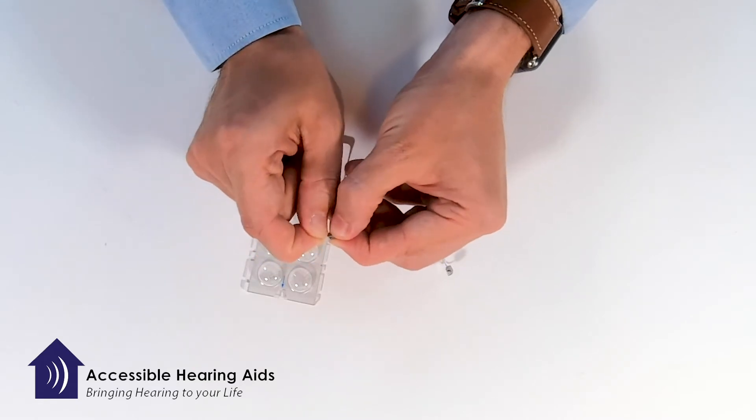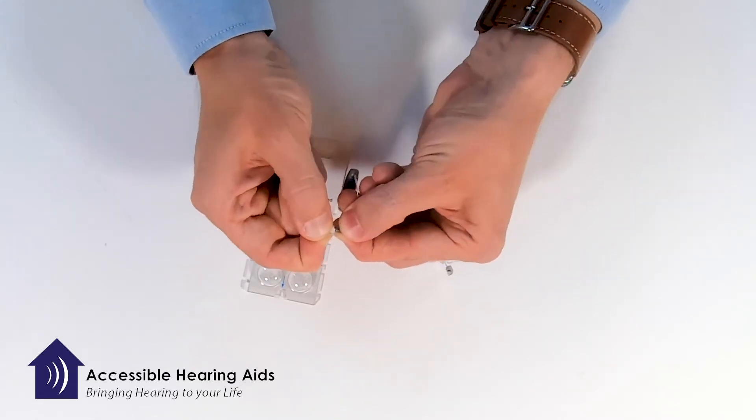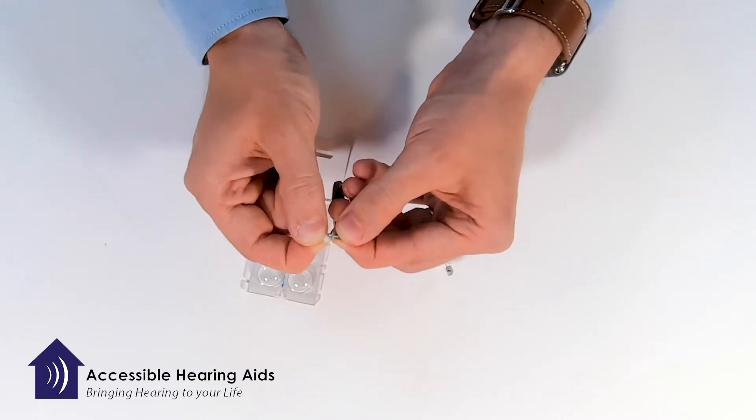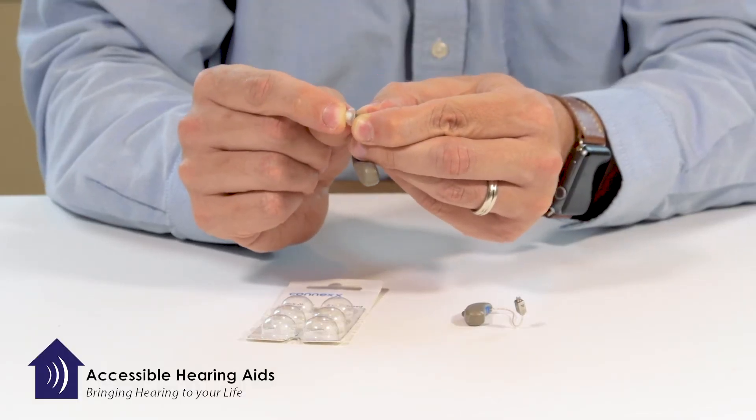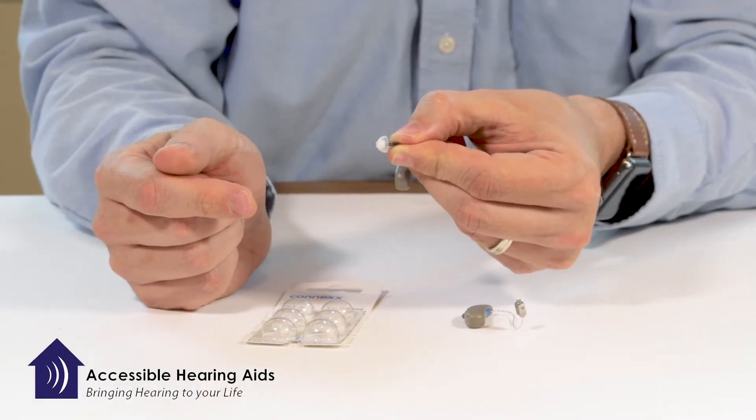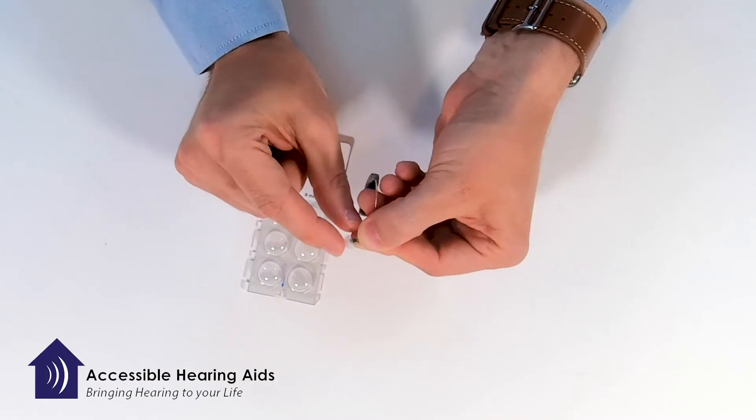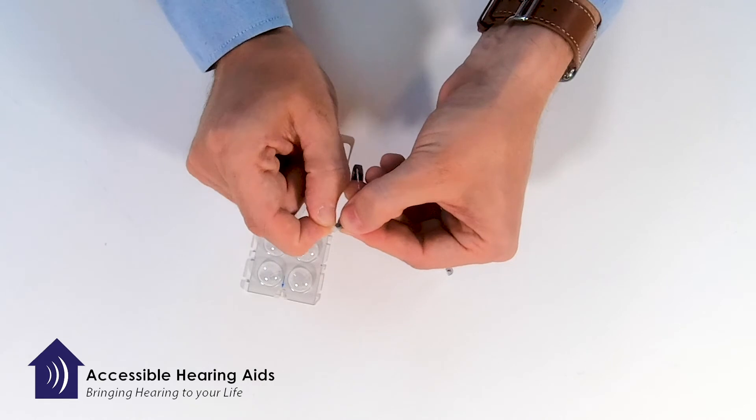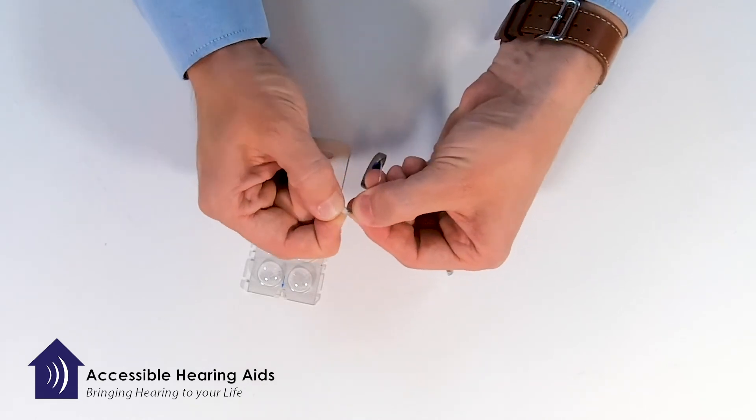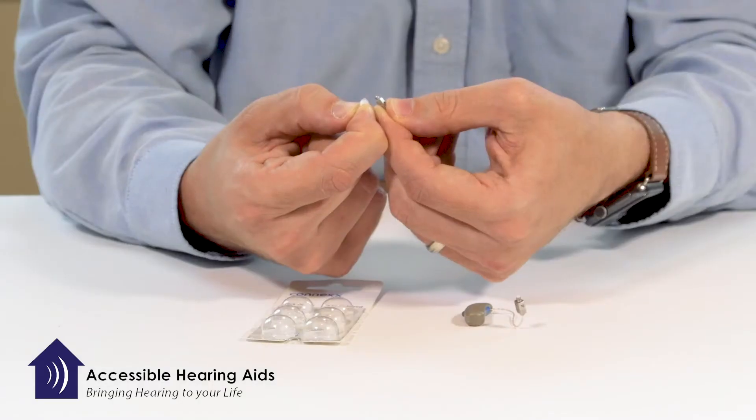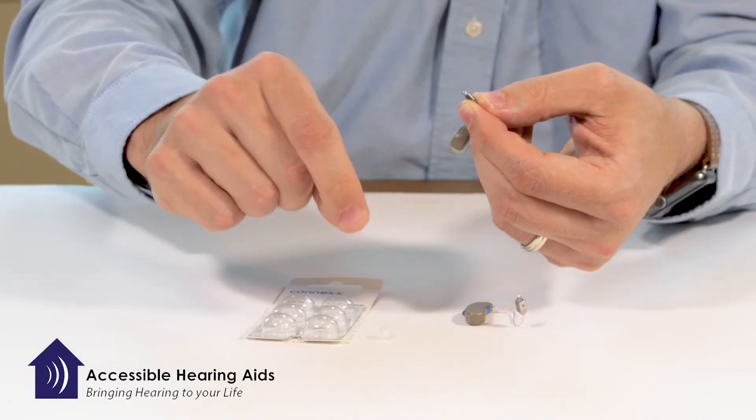You kind of pull apart and then split down. I like to think of - I grew up around a farm with my grandfather and we used to do snap beans, so it's the same type of action if you've ever snapped beans. Pull apart and gently separate, and it should snap right off. Once you have the old one off, you open the pack.